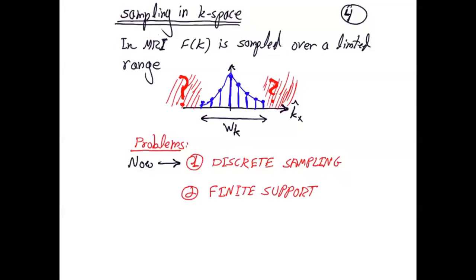Also the content of the frequency domain depends of course on how many features there are and what the resolution of the structures is. There's a lot of fine structure in images, right? So it's really not finite. Okay, so that's an issue.